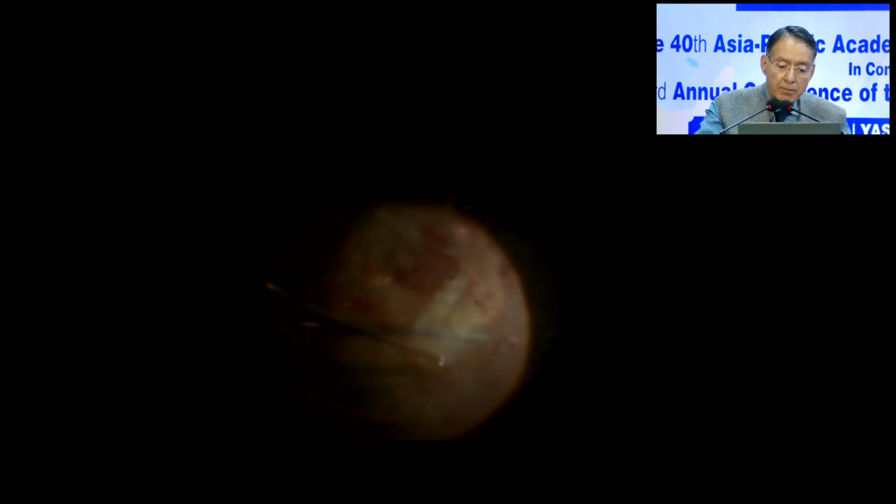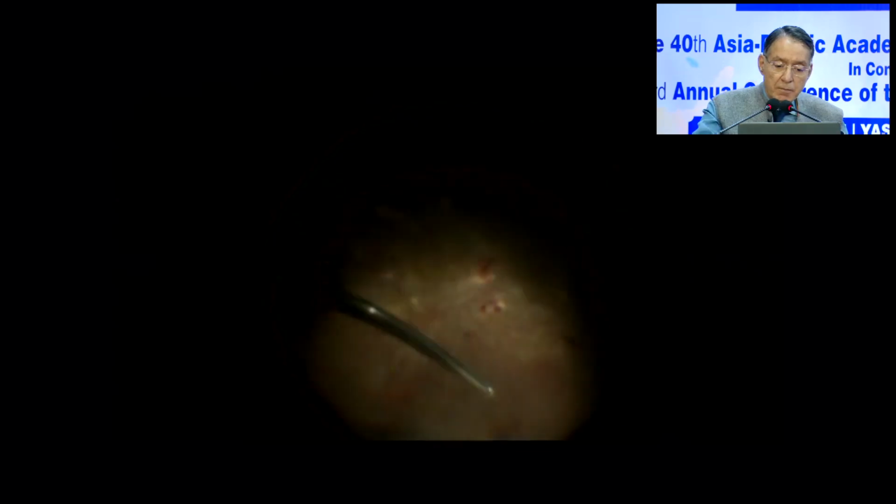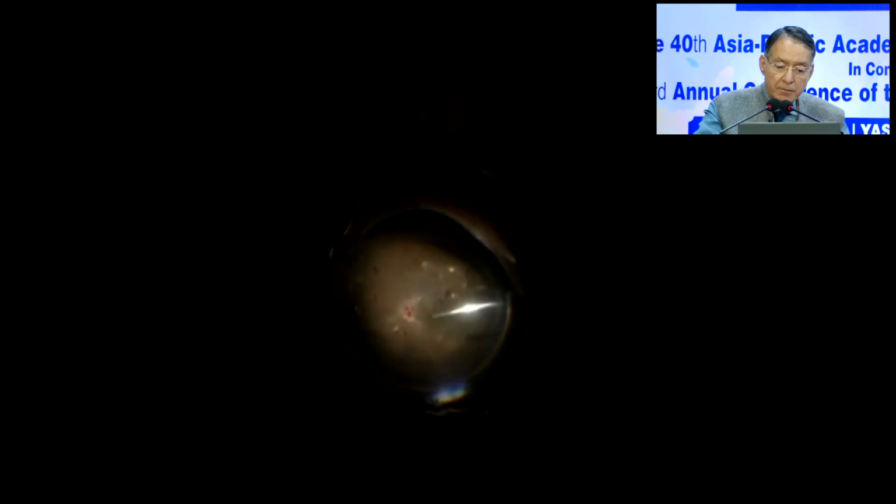Surgery concluded with fluid air exchange, laser and C3F8 gas flush. In diabetic TRDs, gas and not oil is our preferred mode of tamponade.